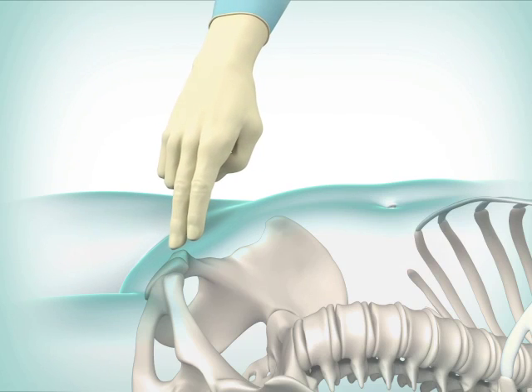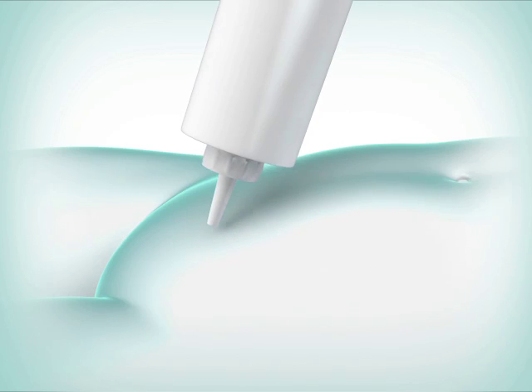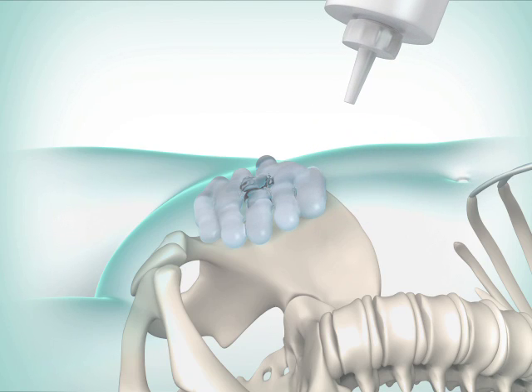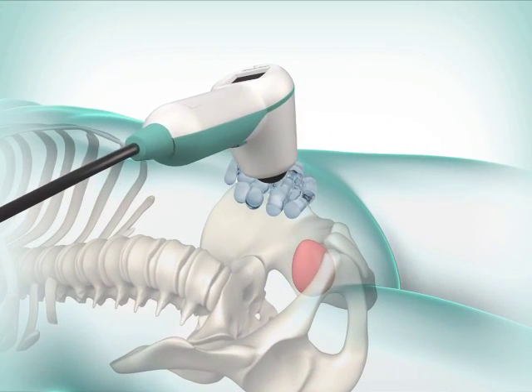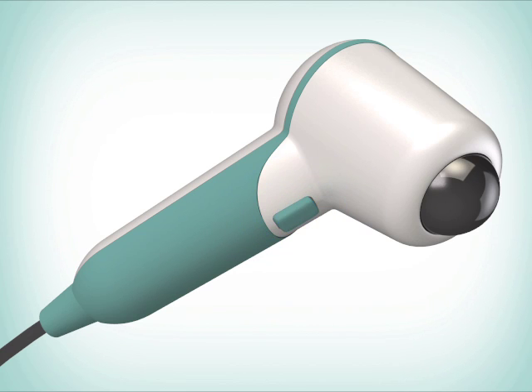Have the patient lie in the supine position. Palpate the patient's pubic bone and place an ample quantity of gel midline on the patient's abdomen, about 1 inch or 3 centimeters above the pubic bone. Standing at the patient's right side, place the probe on the gel and aim toward the expected location of the bladder. Press and release the Scan button located on the underside of the probe.